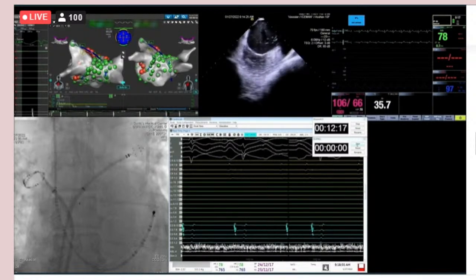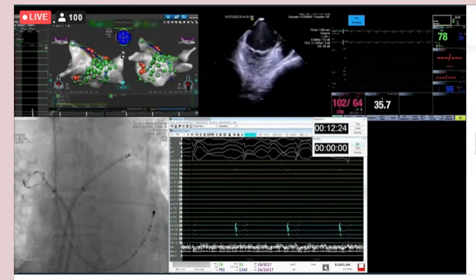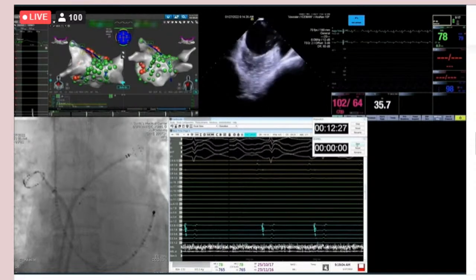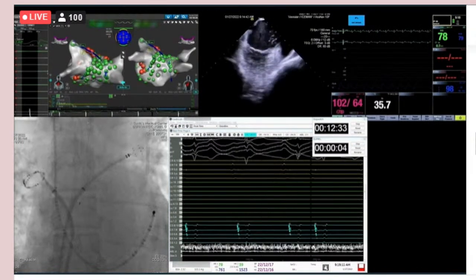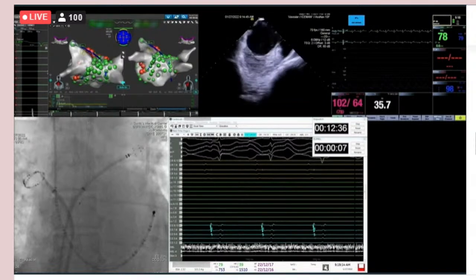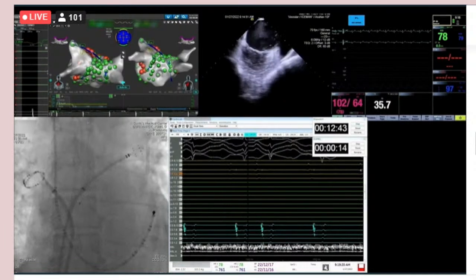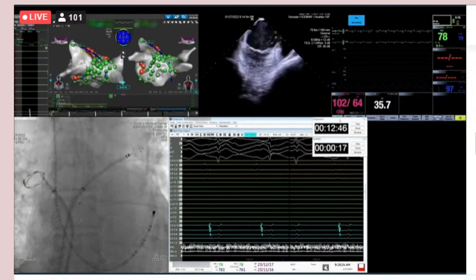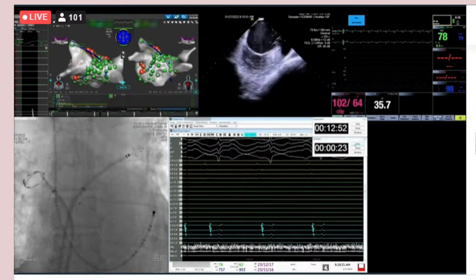Similar to what we saw with other technologies from other companies that have delved into this, they were seeing relatively high recurrence rates, and when they went back in, they confirmed it by seeing relatively high rates of recurrence of pulmonary vein conduction. And so what they did going forward was they changed the recipe of their electroporation and added in RF. And there was still a feeling, even until relatively recently, that, for example, in the ventricle, you would not be able to use electroporation. That may not be true, and further animal experiments have suggested that we may be able to get up to a centimeter of depth in areas with electroporation, which was not felt to be possible before.